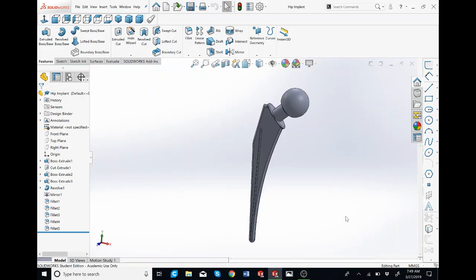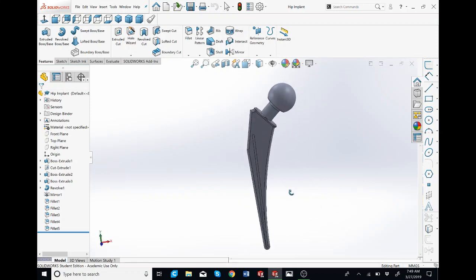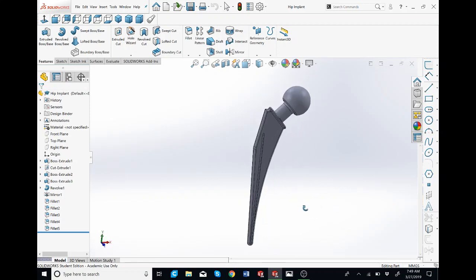Hi everyone, my name is Matt. Today we're going to go over how to make a hip implant. You can see I have the full model over here. Today we're going to go over the first two features.